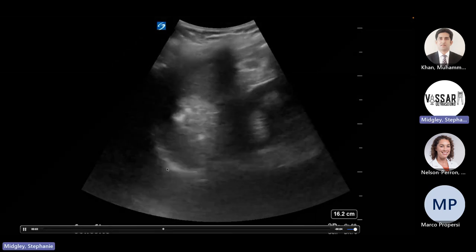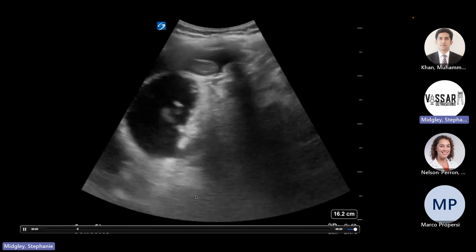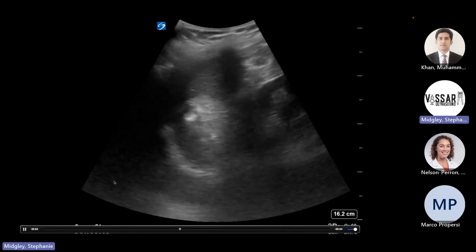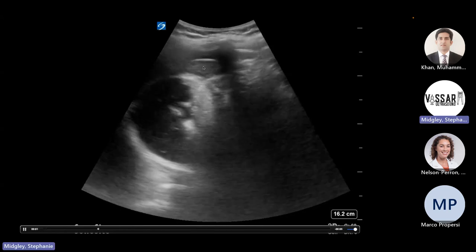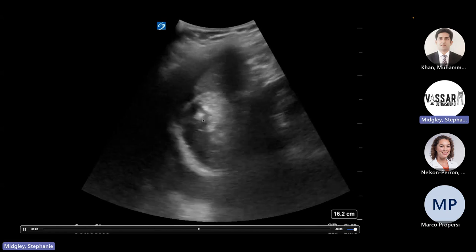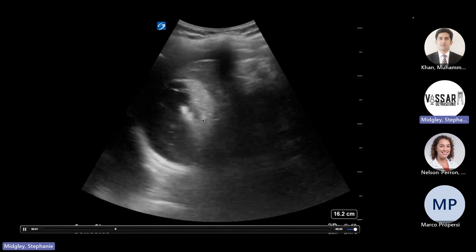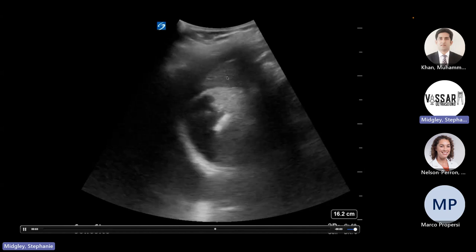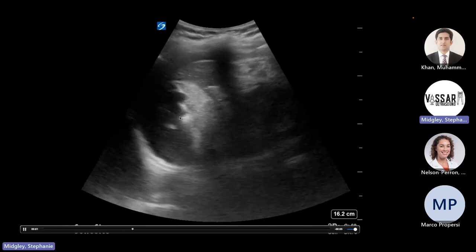There's my diaphragm. I don't really know what's going on above the diaphragm. I think it's a mirror just because I don't see the spine extending upward. And then there's this weird thing. So I know it's deep to my spleen. So again, if I'm imaging very posterior and my beam is aimed up towards the ceiling, I'm going to be cutting through the spleen and imaging the stomach. And again, that's sort of fluid filled.